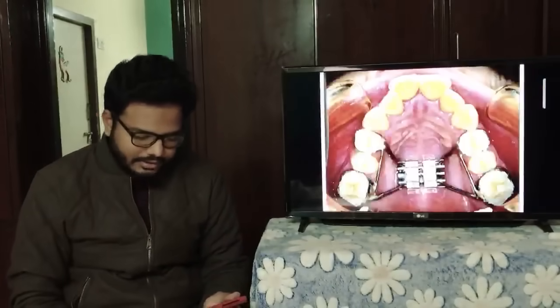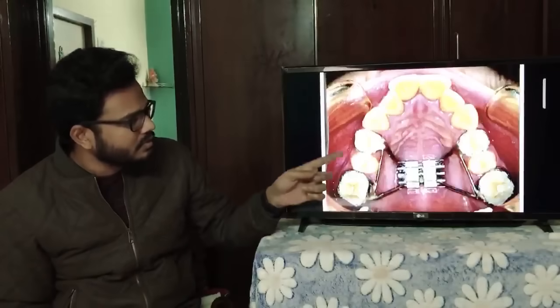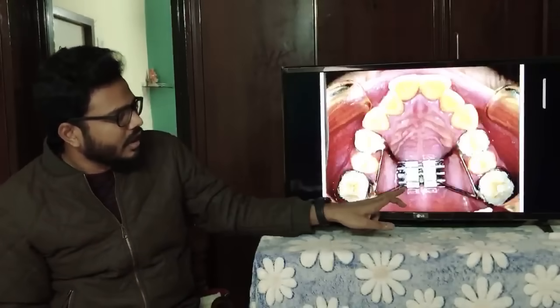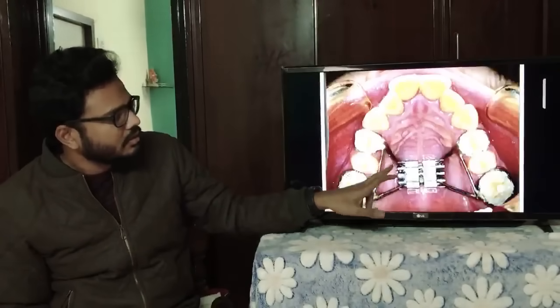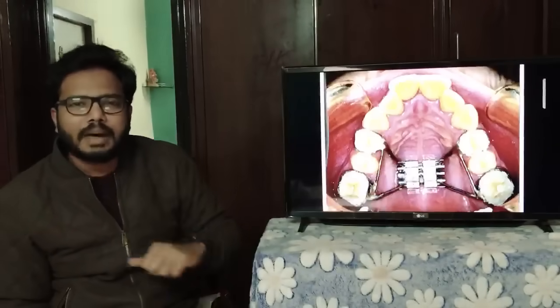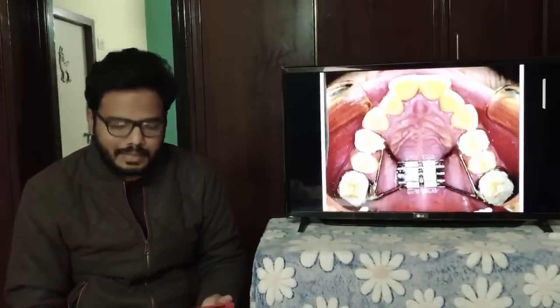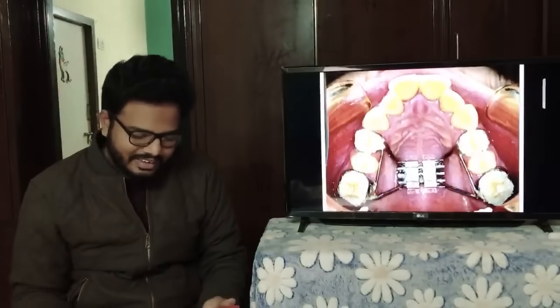Identify this intraoral appliance. You can see bands on premolars as well as molars. You can see heavy gauge wires, and you can see a kind of screw system on the palatal aspect. So what is this appliance? Obviously it seems to be a tooth-borne appliance.